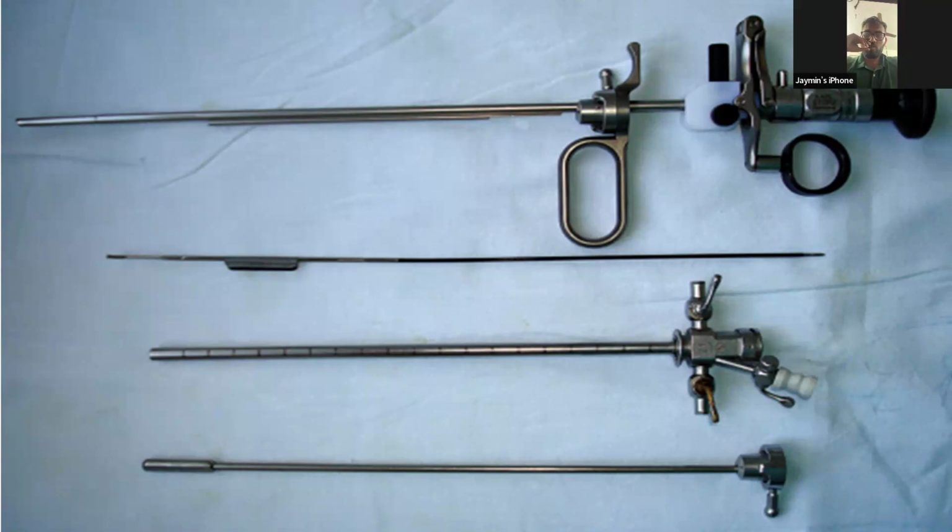Sir, urethral injury and mucosal stricture rates are more common in bipolar, sir, when compared to monopolar. लिटरेचर वाइज तो है वैसा, लेकिन जो रेगुलरली करते हैं उनको उतना एक्सेप्टेबल नहीं है। प्रैक्टिकल एक्सपीरियंस, अगर कोई सर्जन रेगुलरली बाइपोलर करता है तो वो एक्सेप्ट नहीं करेगा, लेकिन लिटरेचर सपोर्टिव है उसको, स्टिक्चर रेट कंपैरेटिवली ज्यादा है। Yes, sir. देन वो जो बाइपोलर और मोनोपोलर में एग्जैक्टली जो अपना लूप रहता है उसमें करंट में क्या डिफरेंस है? व्हाई इट इज कॉल्ड एज बाइपोलर?